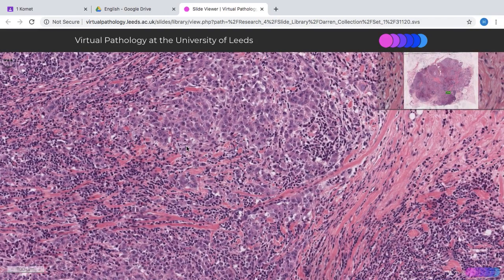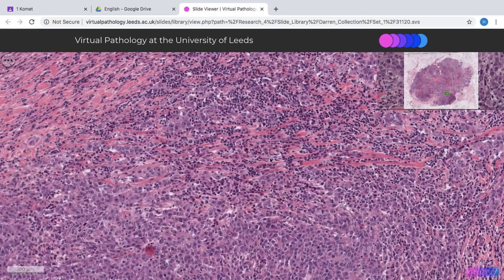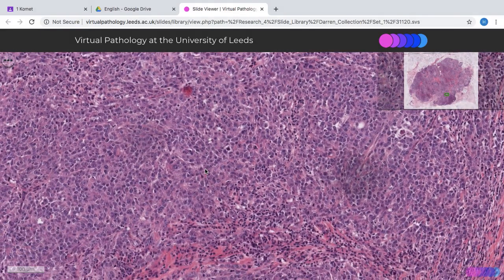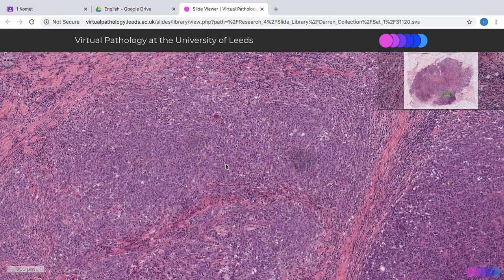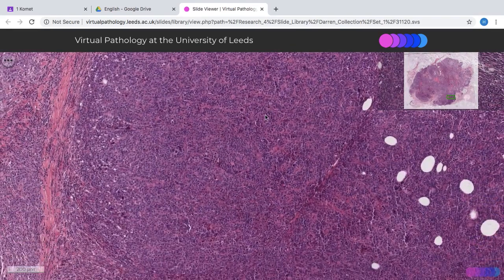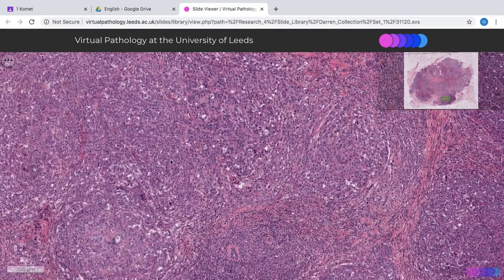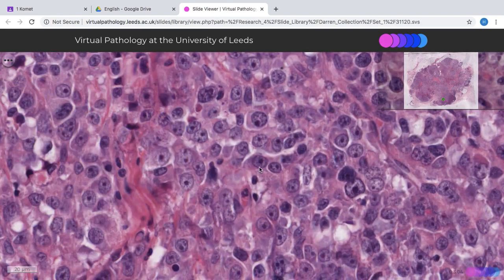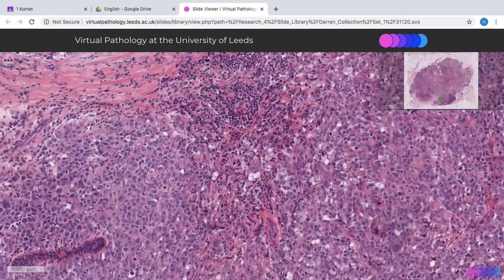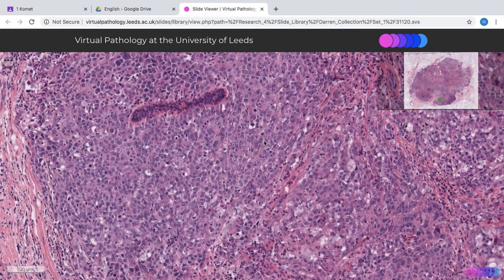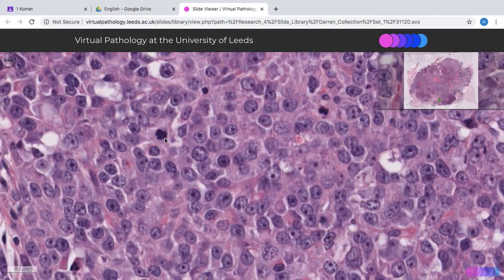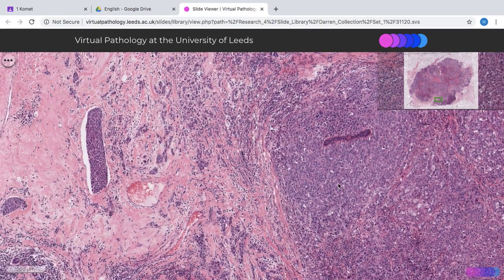In order to give a mitosis score, you actually need to know your field diameter and also quantify the number of mitoses present. Mitoses are counted per high power field. It's quite difficult to do on virtual microscopy because you don't know the field diameter, but under a conventional microscope you should be able to quantify that fairly accurately. For example, there's one mitosis there with a fuzzy border — you count how many and give a total score.